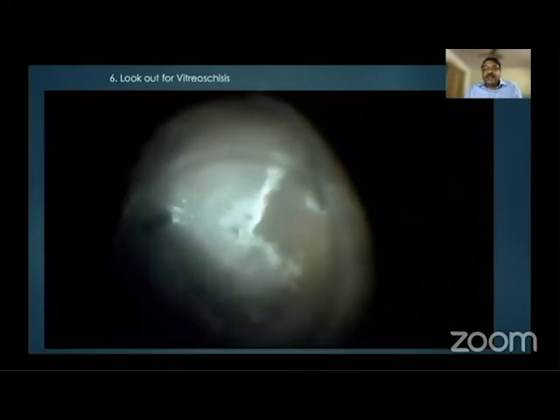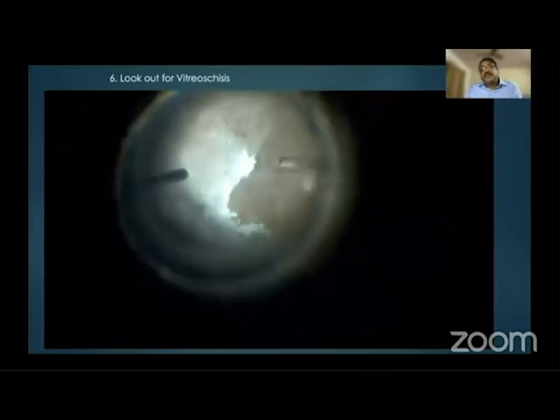Here you can see that I have cleared the hemorrhage in a patient of non-resolving vitreous hemorrhage. And on staining with triamcinolone, I can see the vitreous cortex is present. I identify the vitreous cortex and use the cutter to remove this vitreous cortex to the extent that we can. If I had left this alone, there would be a chance for rebleeding in these patients.